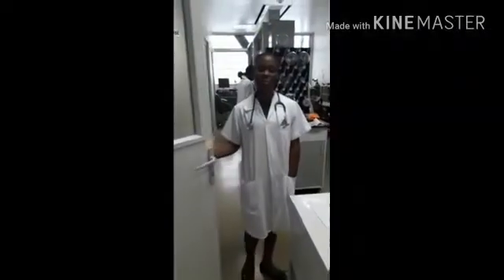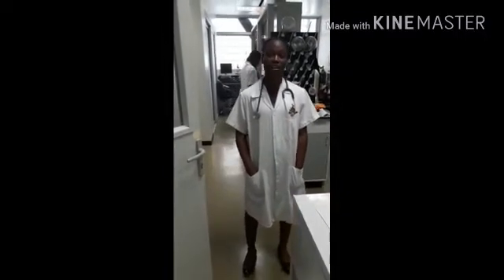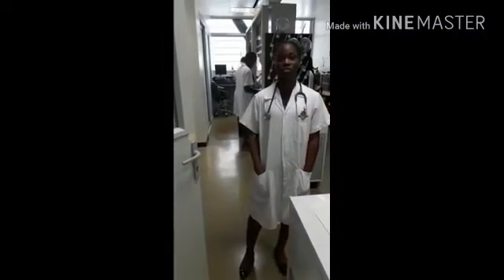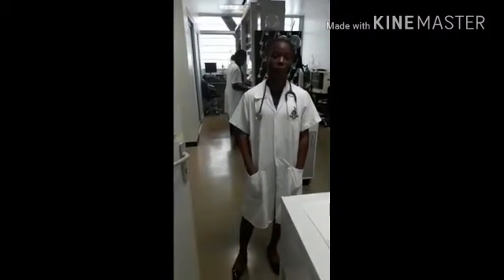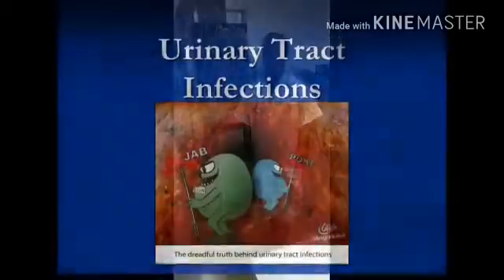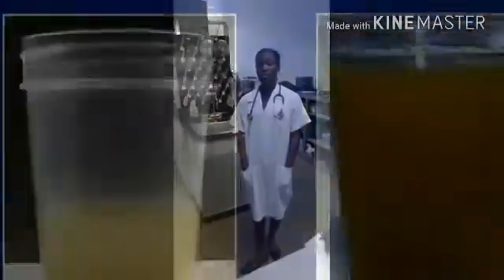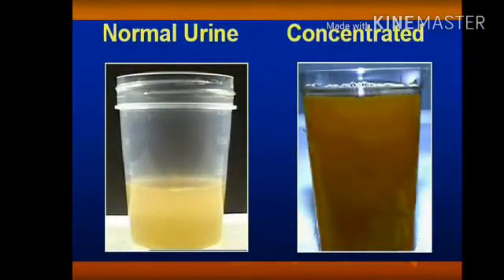Good afternoon and welcome to our lab. I am student nurse Lacian Lamont, and today we will be conducting a series of urinalysis tests. Urinalysis tests are done to detect and manage a wide range of disorders such as urinary tract infection, diabetes, liver, and kidney disorders. It involves checking the appearance, concentration, and the content of urine.